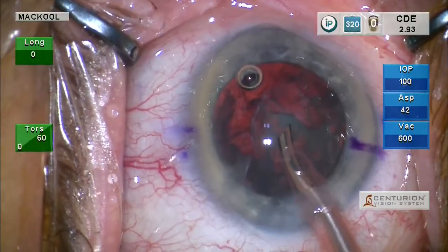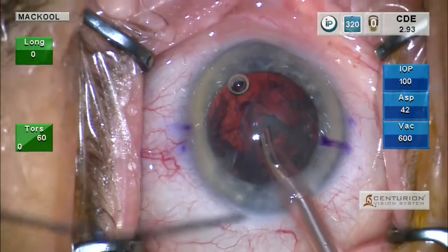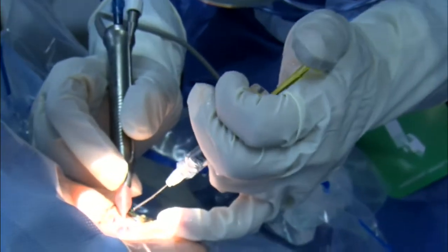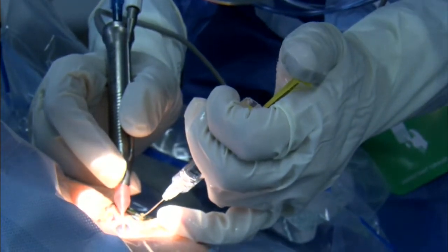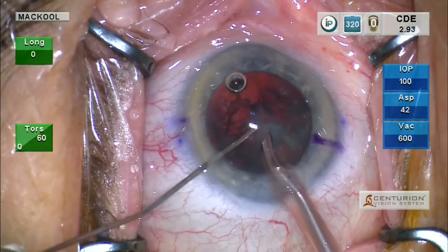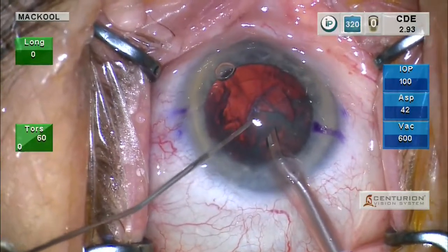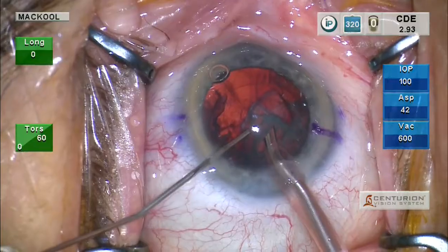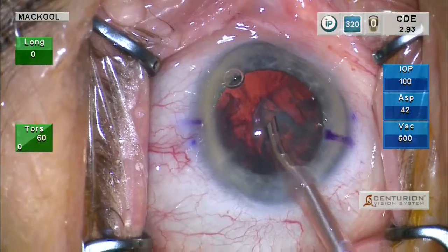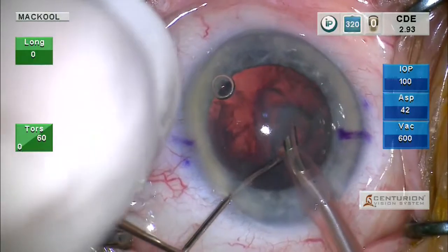And this technique of putting more viscoat in the eye, I'm going to use my left hand and my thumb on the plunger. And if I can get a finger down on the eye, on the periorbital area, to stabilize my hand, then when I get in, I'll go to position 0 and just inject more viscoat right in the center without ever coming out. Because if I came out of the eye, the chamber might shallow enough and that last remaining segment might come forward.